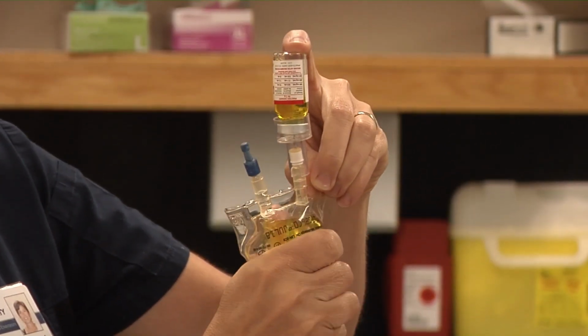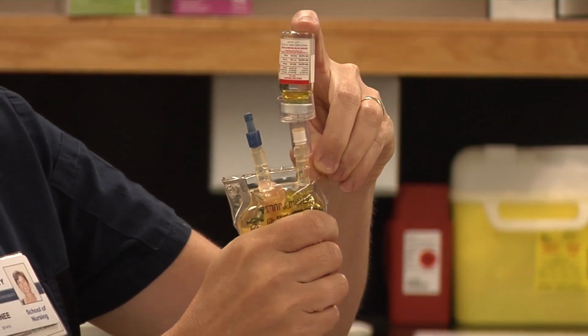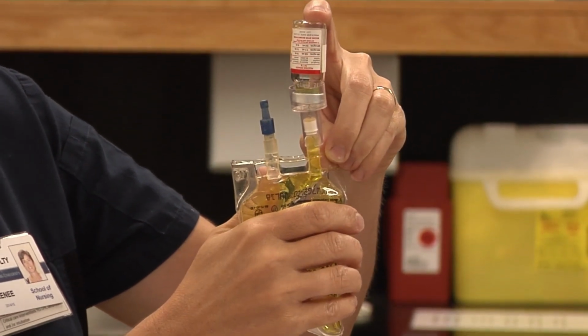I often say to students, it's like milking a cow. Until I had a student say to me, you've never milked a cow, have you? And I haven't. That's right.